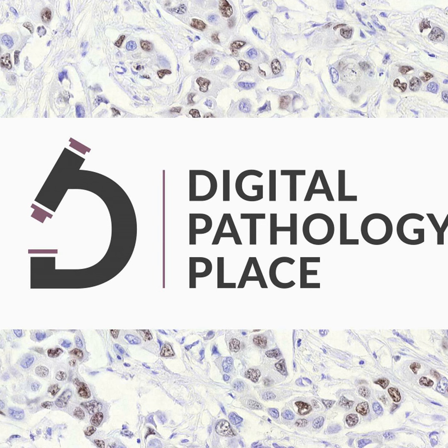Let's say a different run of IHC from the same lab that was a little fainter. Do you run the same algorithm on it, and then you have a readout from this algorithm that does not really match the tissue? Or do you exclude this from your data pool, and then you have different methods on your data cohort? I am a proponent of different methods that give you a good result that matches the tissue. There are people who think differently.